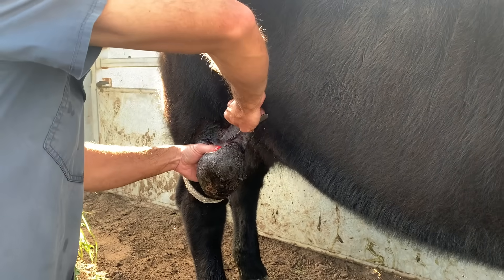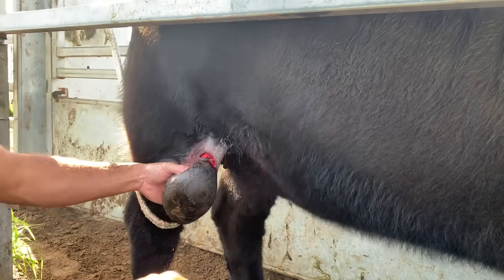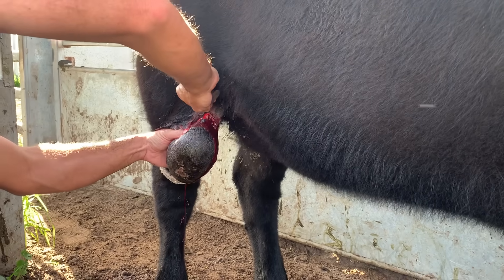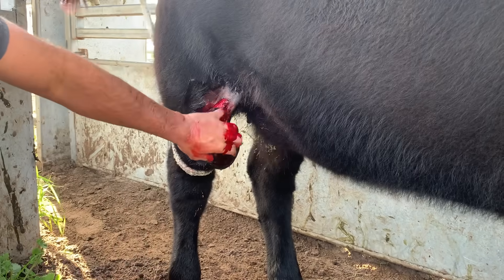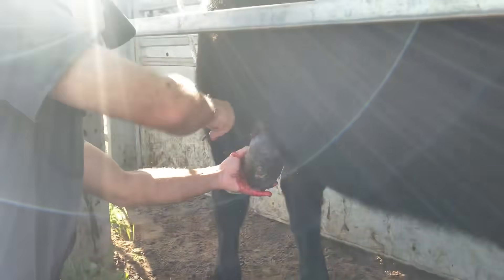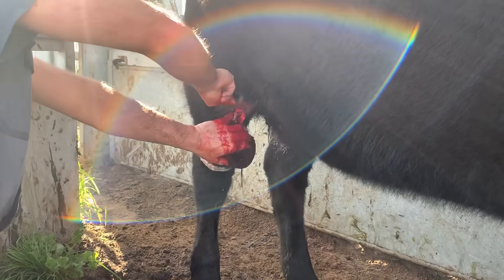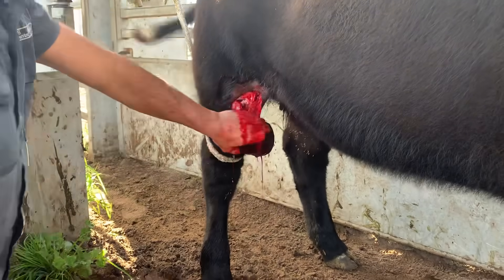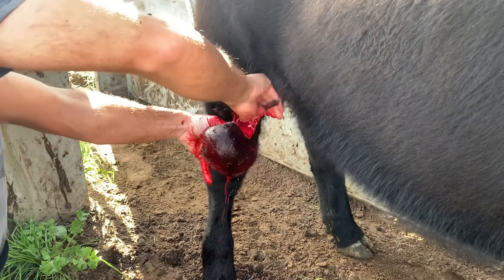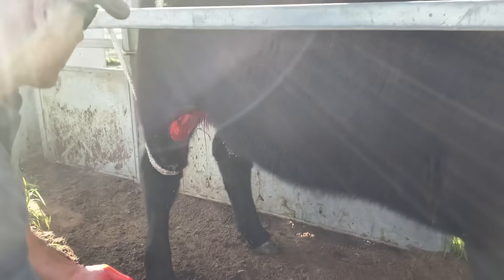The key is, on these sorts of things, nice quick cuts — kind of like when you're lancing an abscess — so that if she jumps, she's not going to cut things that we don't want to cut. Here's our bleeder that we knew we were going to find, something that's been supplying this mass. Obviously this mass frequently has blood supply. Again, quick cuts, guys — we don't wear the scalpel, so she doesn't wear the scalpel. That's pretty cool. Look at that for the camera, man — a little bit of a bleeder there.